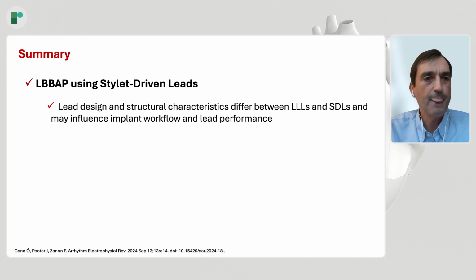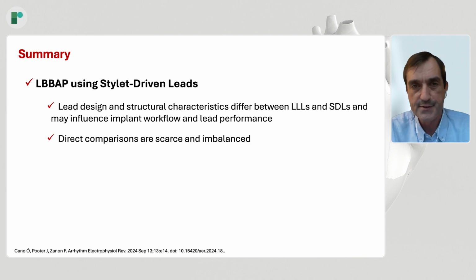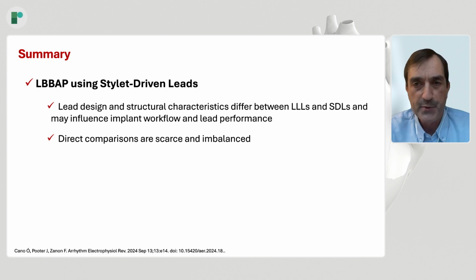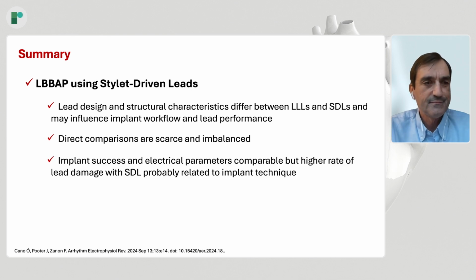Summarizing, with respect to the use of stylet-driven leads for left bundle branch pacing, we have to be aware that lead design and structural characteristics differ between both lead types and may influence the implant workflow and lead performance. Direct comparisons are scarce and imbalanced because we have longer experience with lumenless leads. Next, please.